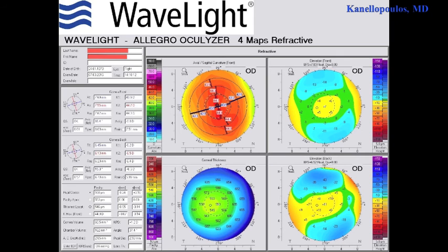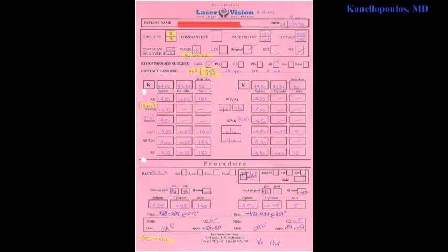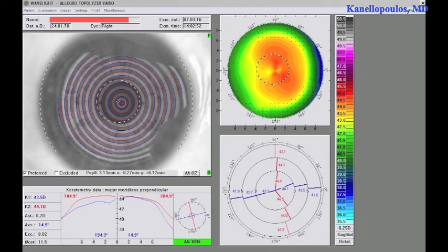This is a young myopic patient, nothing important on the pentacam, good thickness. This is a refraction, minus 4, very little astigmatism, minus 0.25 as you can see here, also on wavefront.